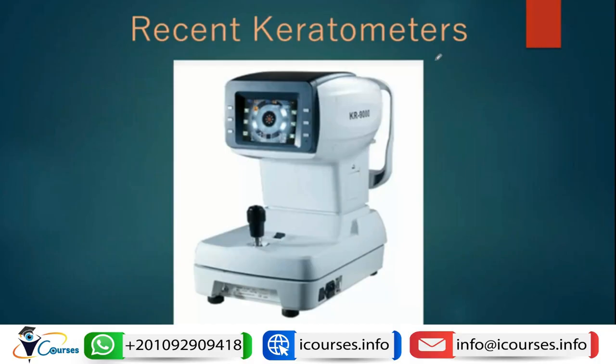So the use of manual keratometers is decreasing nowadays, because they need some level of training and practice in order to have a good reading, and also they don't work well with irregular corneas and corneas with scars. So the use of recent keratometers has greatly replaced them.